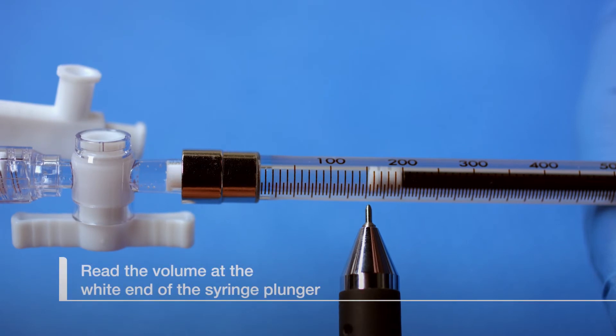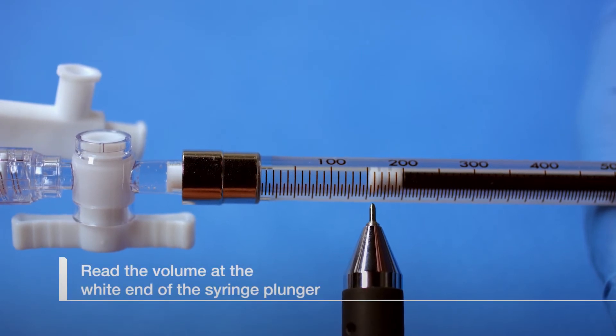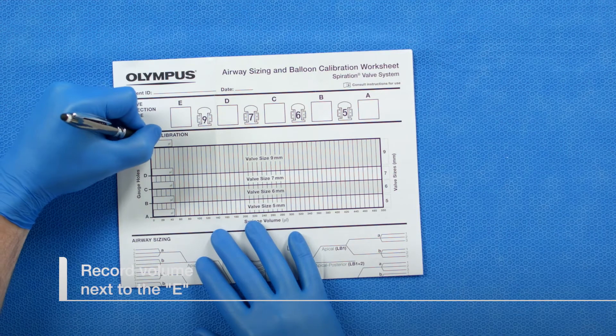Read the volume at the white end of the syringe plunger and record the volume next to the E on the balloon calibration section of the worksheet.